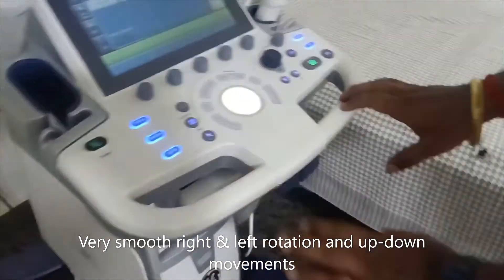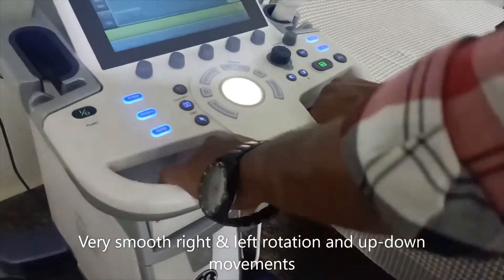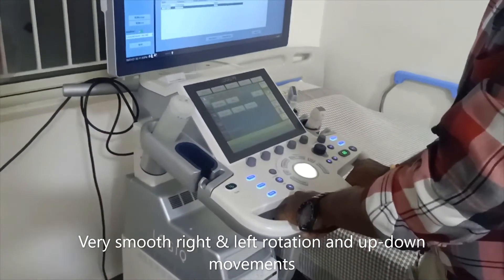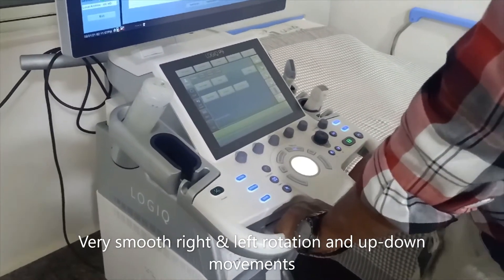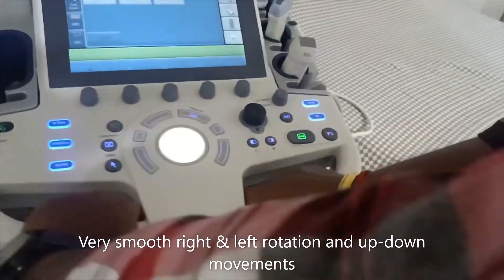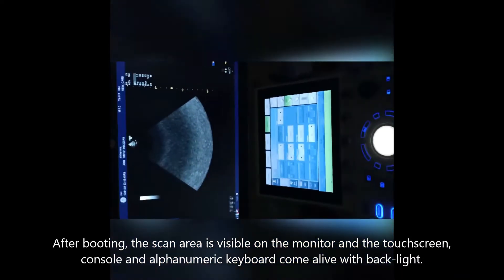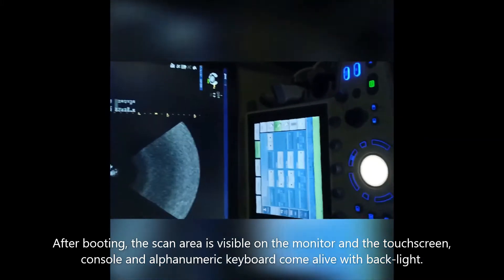There is a left and right rotation option for the console, as well as a height adjustment option. Because of these adjustments, if the patient needs to see some images, once boot is completed you can see the scan area on the LCD display, and the touchscreen is also fully booted.